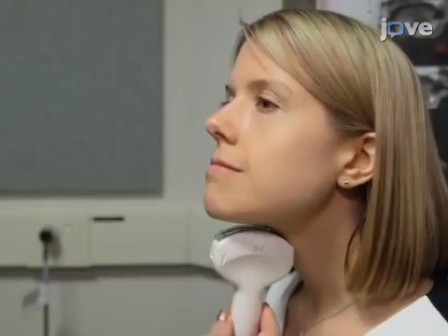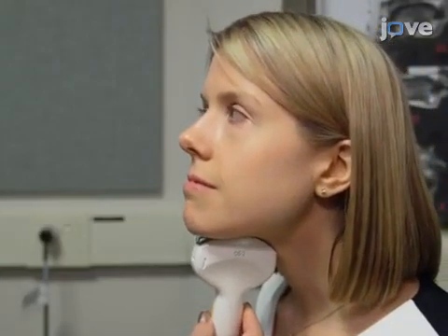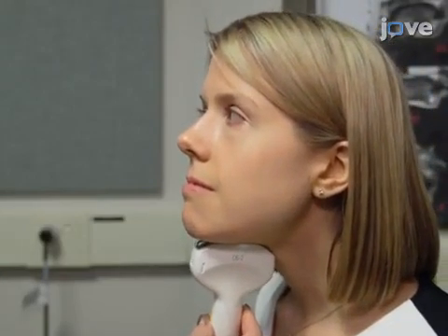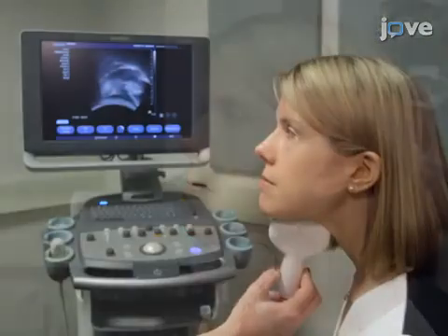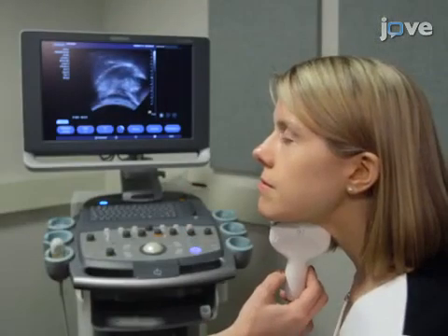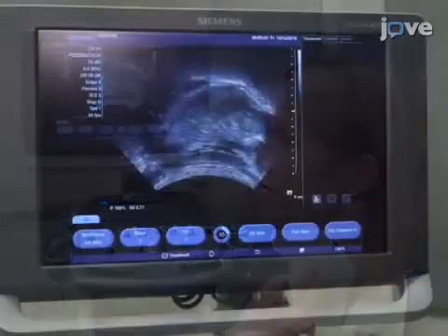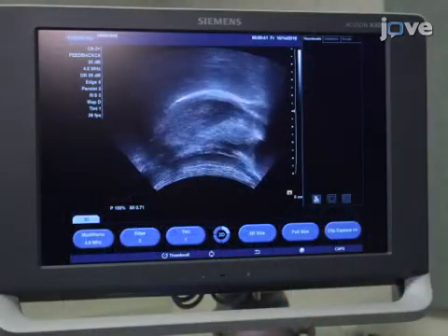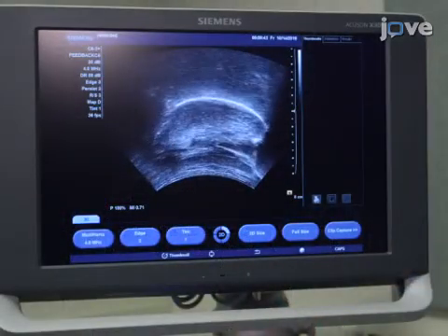Next, position the transducer vertically, making tight contact with the skin underneath the chin and applying a firm but not uncomfortable degree of pressure, to collect a sagittal image and visualize the tongue from tip to root.